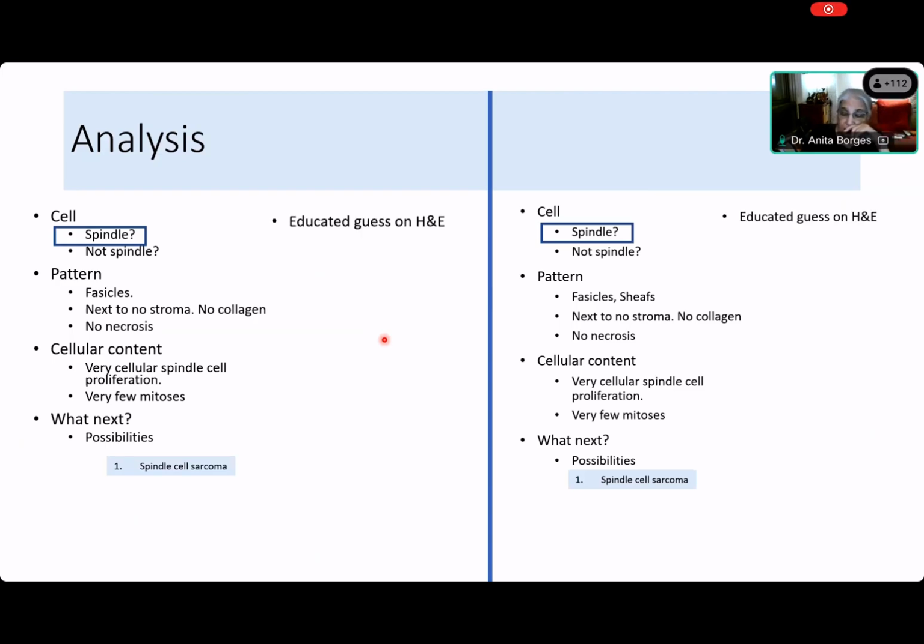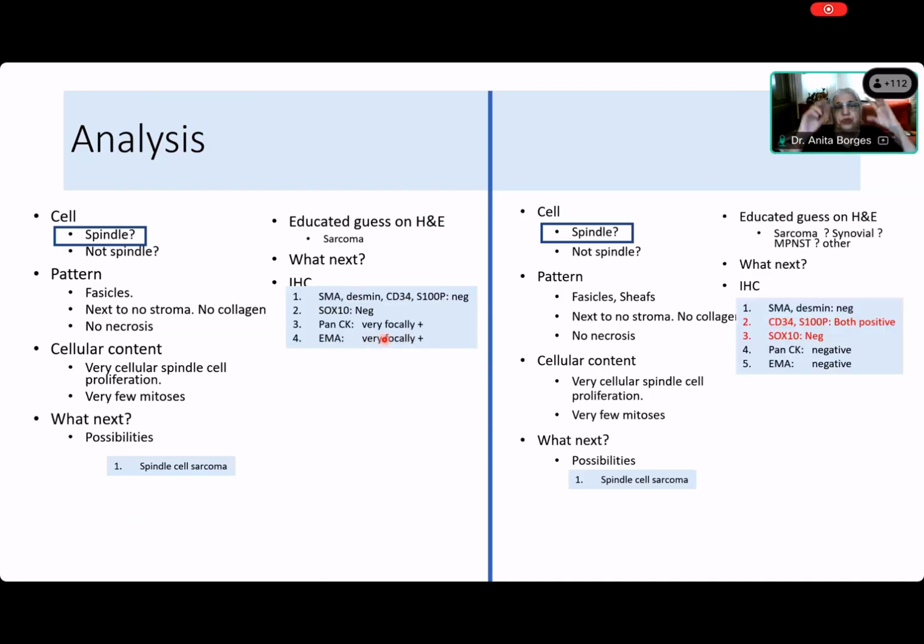So what is the educated guess on H&E? On both sides? This side it's a sarcoma because it's in the arm. Over there, what is it? Well, perhaps it's a synovial sarcoma, maybe MPNST, God knows. That's the educated guess. So what next should we do? Immunohistochemistry. So what immunohistochemistry? SMA, Desmin, S100. Yes, so every time you have a soft tissue sarcoma, that's what you have to repeat. So SMA, Desmin, CD34, S100. Now we did it.